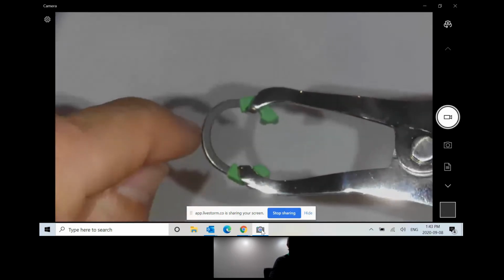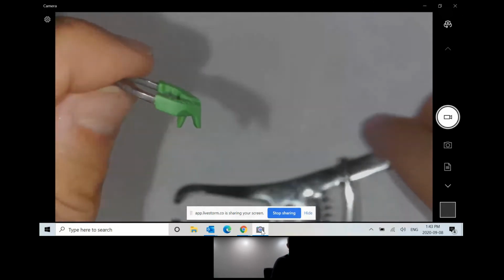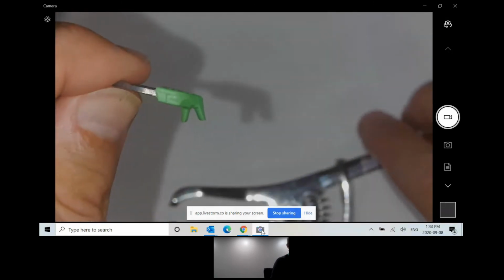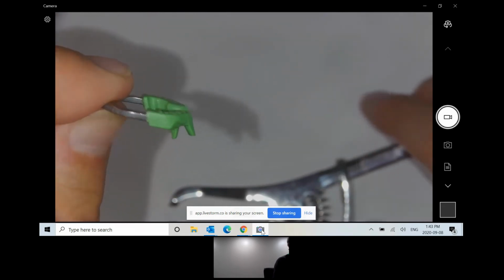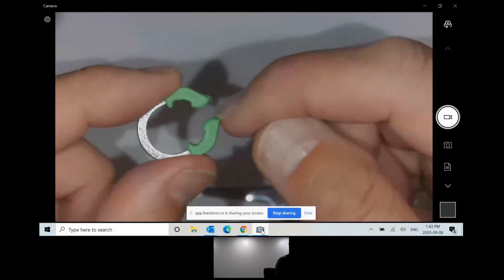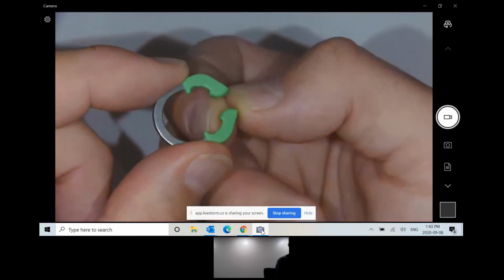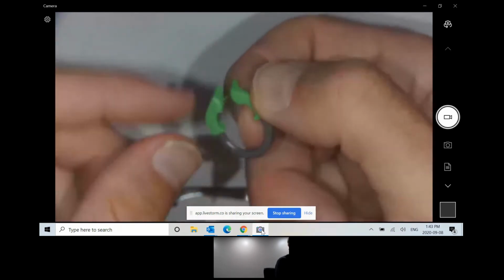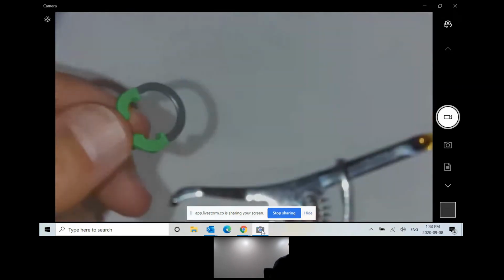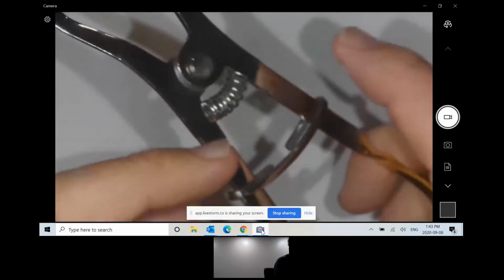Every time you open the ring, you create stress right there. Also, the profile of this ring is fairly low, so there's the issue with rubber dam clamp and placement, and this is all single piece construction. So sometimes it adapts well to the lingual surface of the restoration, but doesn't adapt so well to the buccal surface.